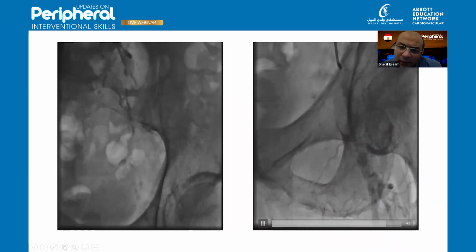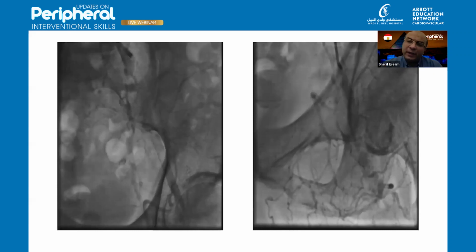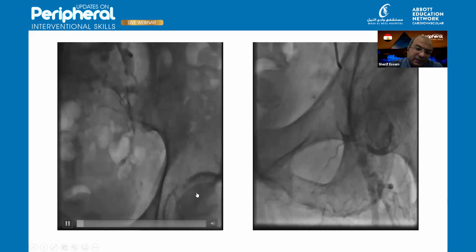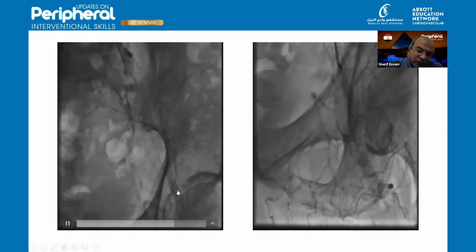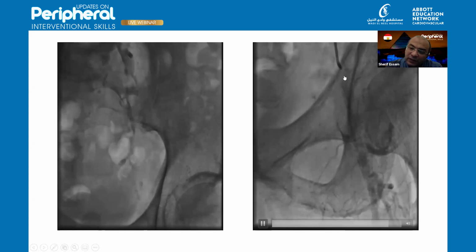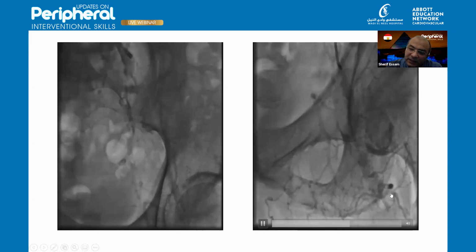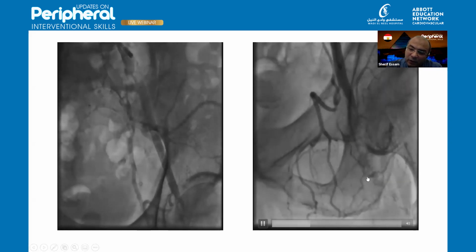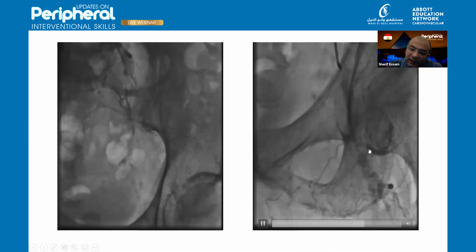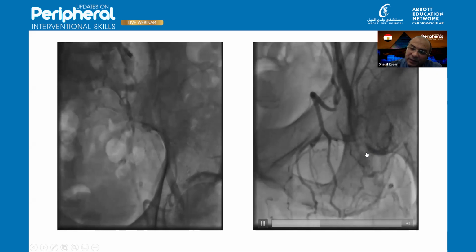Now, coming from above the brachial, this is the first angiography in here. As you can see, that's the head of femur, and we noticed that there's something going on here. So we took another image further on the head of femur, and as you can see, that's the calcium in the common femoral artery, and that's the bifurcation into SFA and profunda, and you can appreciate the amount of calcium in this area.